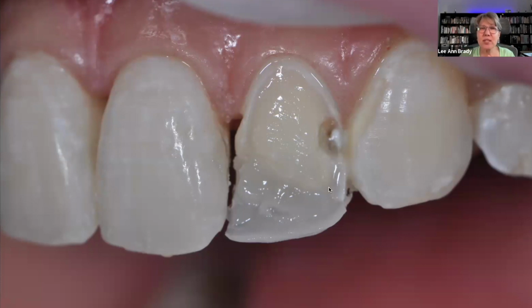Now, what I'm going to do in this case is I'm going to add where I need dentin, right? The composite that I add actually should be a pretty exact match to the chroma and hue of the dentin we can see in the natural tooth. And I'm not going to come all the way to the incisal edge. This is a 16-year-old patient. And you can see if you look at the adjacent centrals, she's got a pretty nice 1.5 millimeter band of just pure translucent enamel on her incisal edges. If I look at her centrals, she doesn't have super dramatic lobes of dentin, but a little bit.